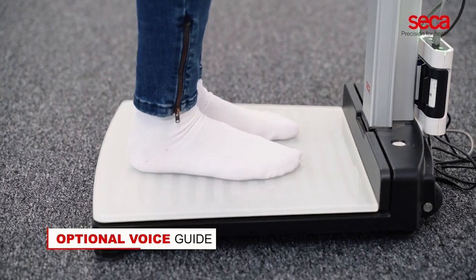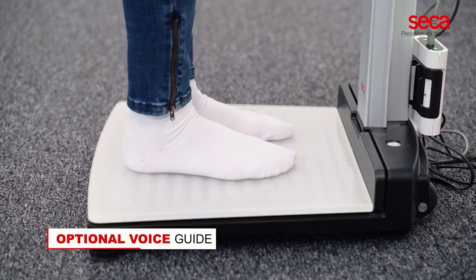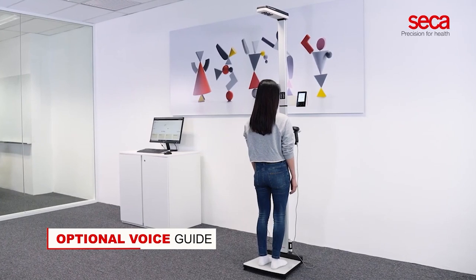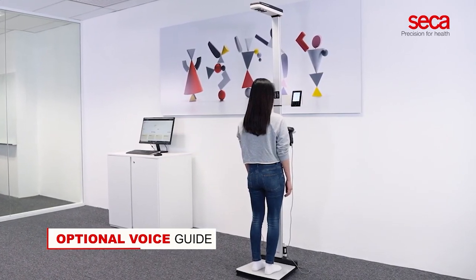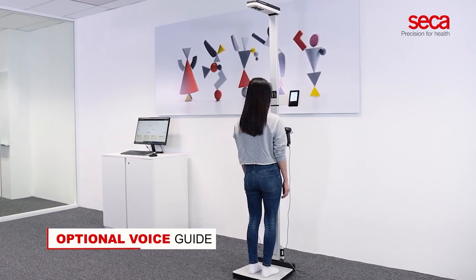Please stand upright and look straight. Do not move. The measurement starts now. The measurement is completed. Please step off the platform.